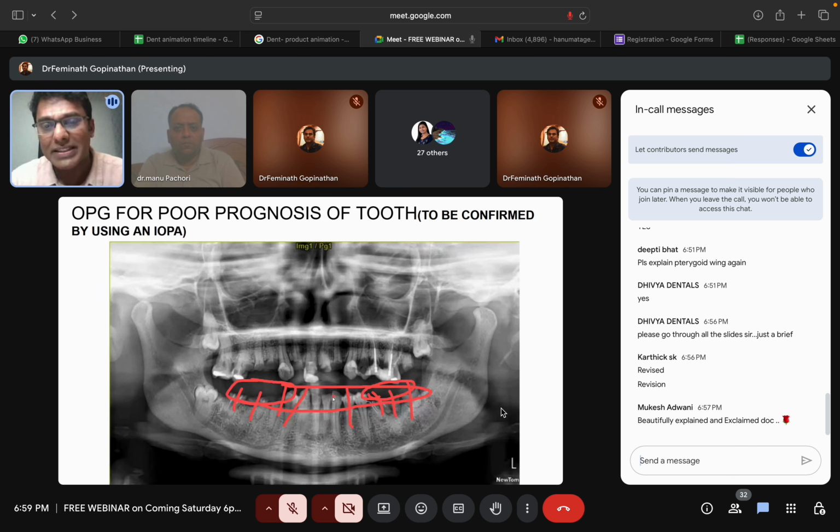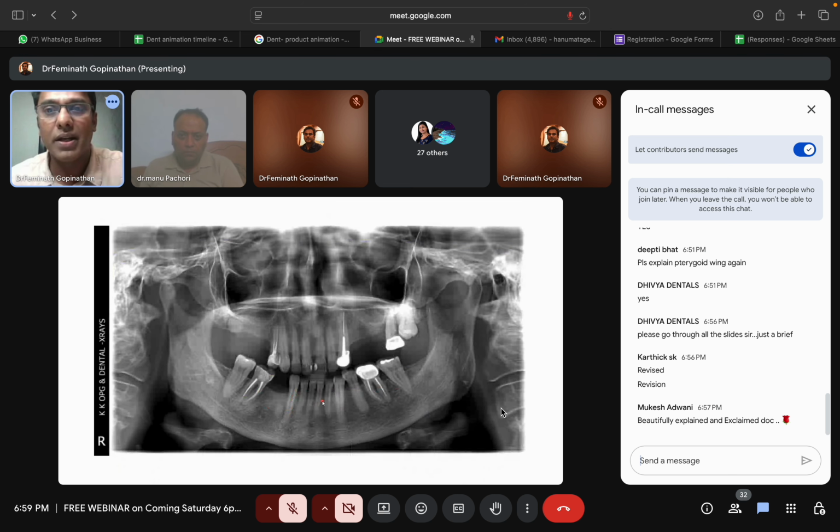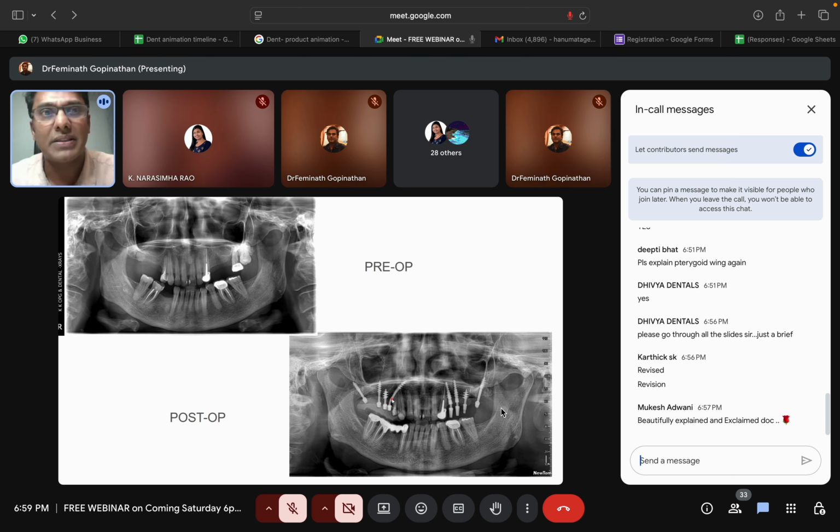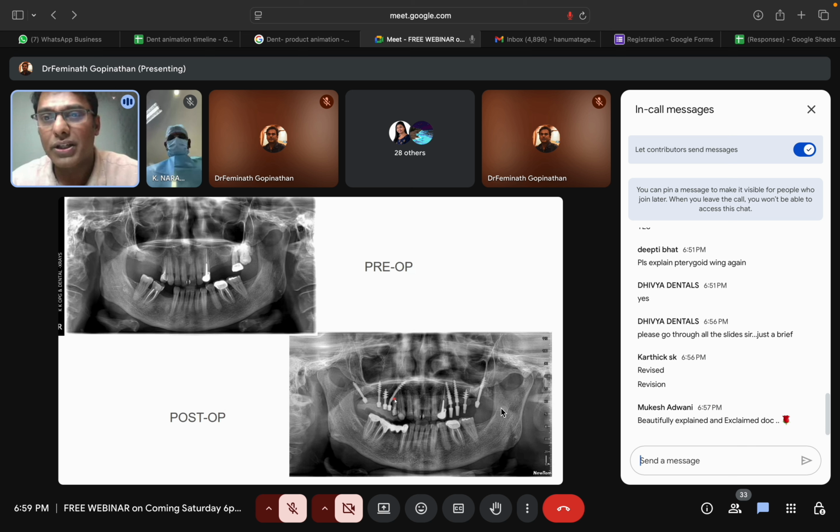But the disadvantage is that sometimes the patient might psychologically feel that they want a few teeth to remain, which is actually illogical. I hope this aspect is very clear. Now similarly, these two teeth have a very bad prognosis, so a bridge was not planned and implants were planned in this. Now you can see how these two were removed and then these implants were placed like this. You can see there is a bypass of the premolar to the lateral wall of the nose. This area was bypassed.